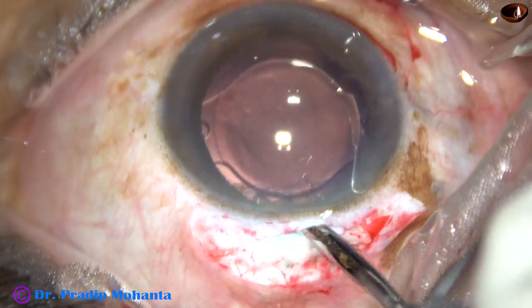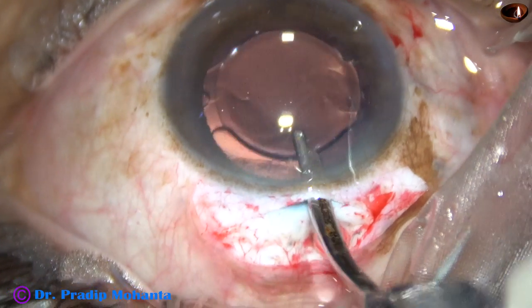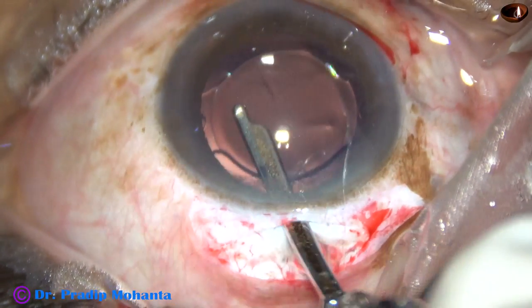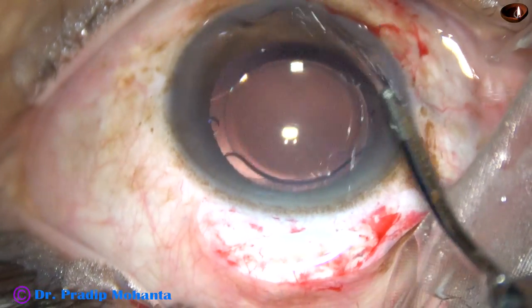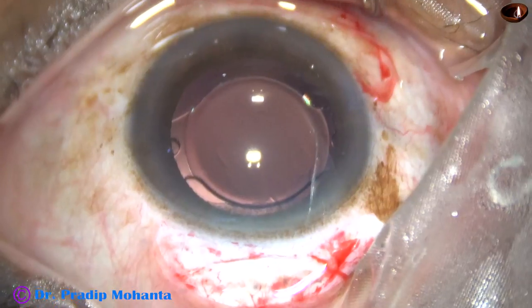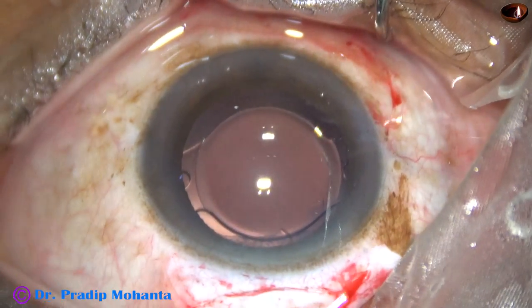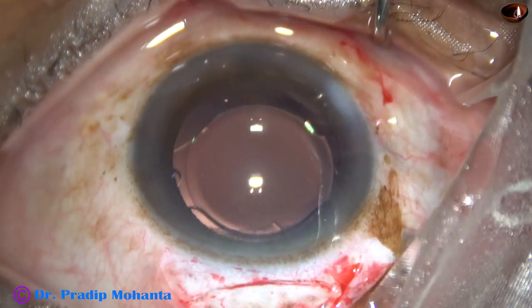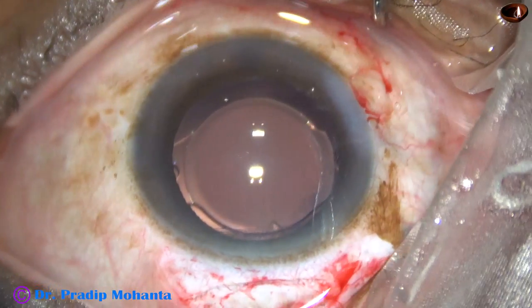Now the visco from behind the intraocular lens as well as from the anterior chamber is removed. We must remove the visco very nicely; otherwise there can be raised intraocular pressure in the postoperative period. Particularly, a lot of visco is retained behind the intraocular lens. So we must go behind the intraocular lens, irrigate the capsular bag, and all the visco from the capsular bag will come out through the main wound.